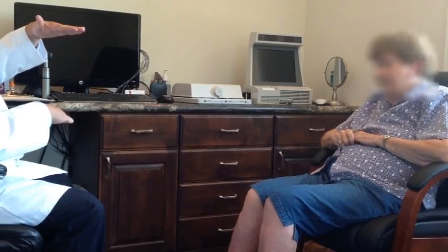Then I'll do a little bit of speech testing where I'll have you repeat some words back to me. We want to make sure that the speech calibrates up with the beeps and that everything matches up. Then we'll finish off with some loudness testing where I'll have you tell me when things get too loud. We want to find the very softest level you can hear sounds and when sounds get too loud, so we can set the new hearing aid to fit within that range.